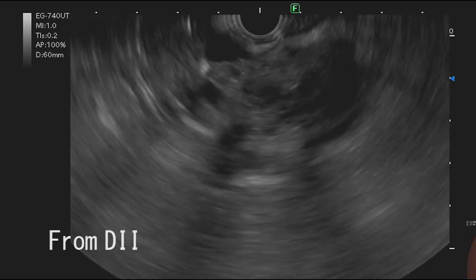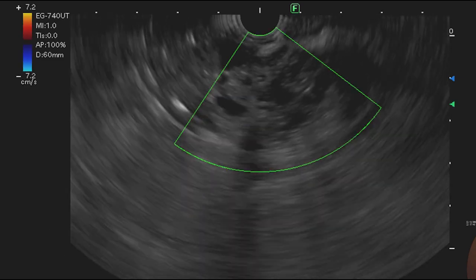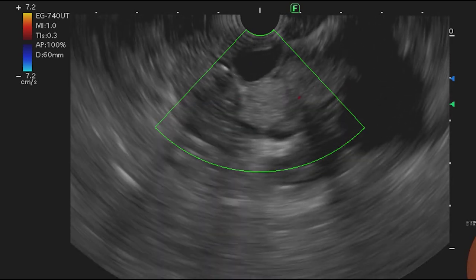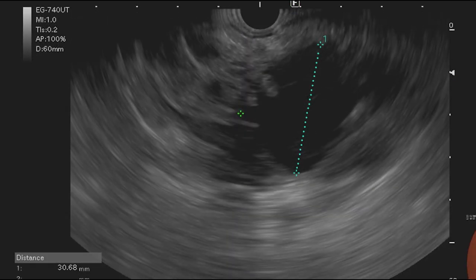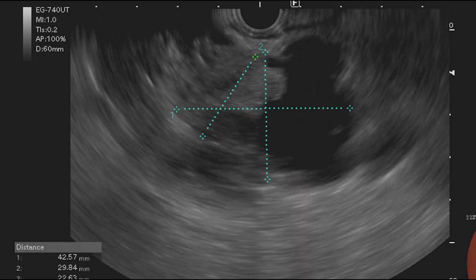The cyst expressed a microcystic component, similar to a grape bunch aspect, a few peripheral macrocysts, a central hypoisoechoic area suspected for malignancy, and an anechoic liquid portion. The size of the lesion was more than 3 cm, confirming this worrisome feature. In addition, a clear connection to the MPD was not possible to detect.